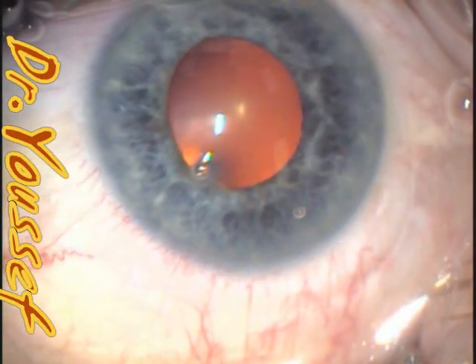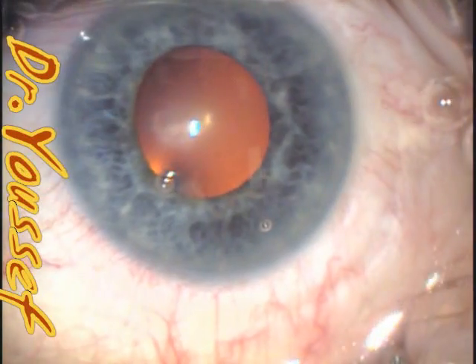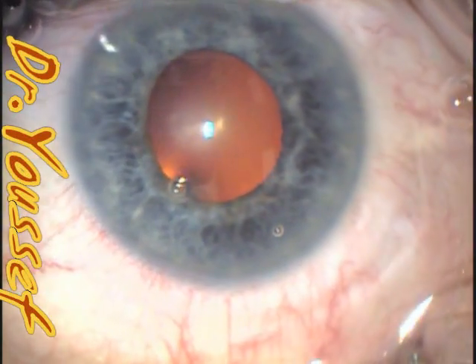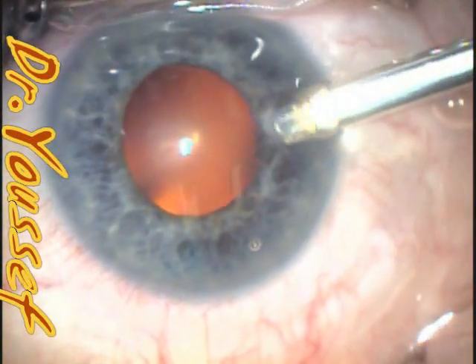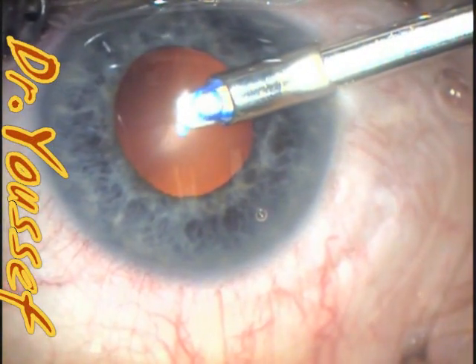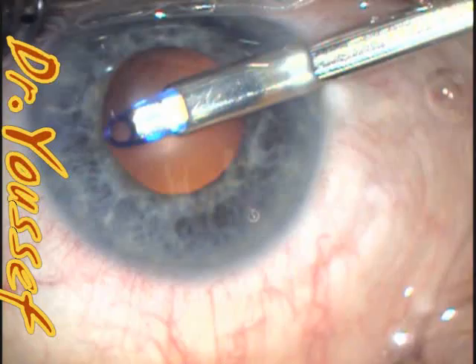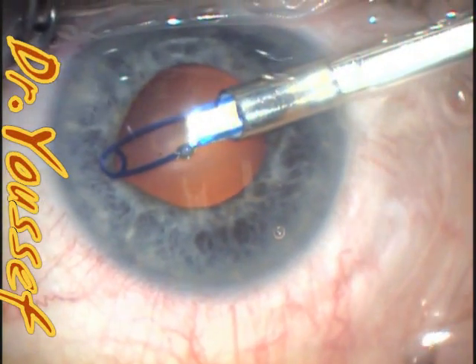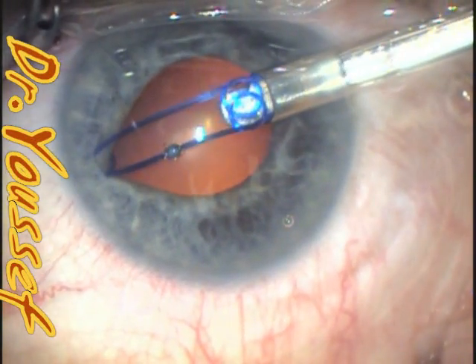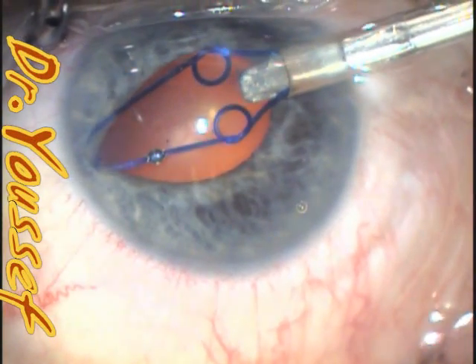I work temporally, so the nasal part is the one that is going to be first engaging. I've slowed down the video so that I can have time to talk and explain what I'm doing. This is the injector and this is the nasal part of the ring. The nasal part will engage the nasal part of the pupil, and as I'm doing that, I'm dragging the injector.